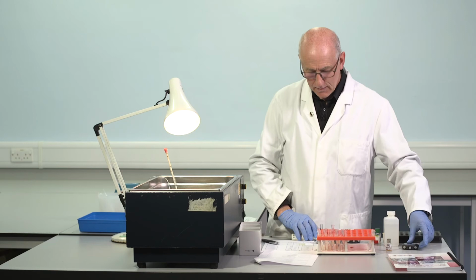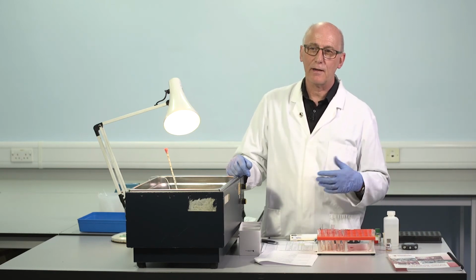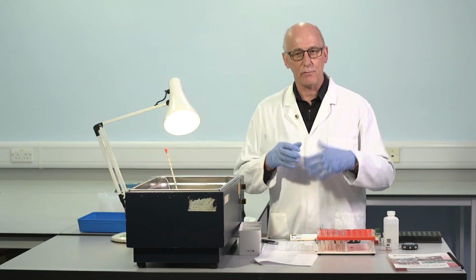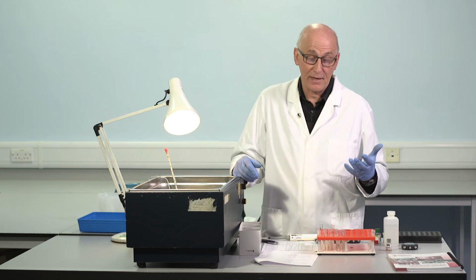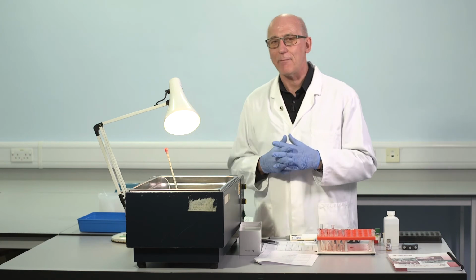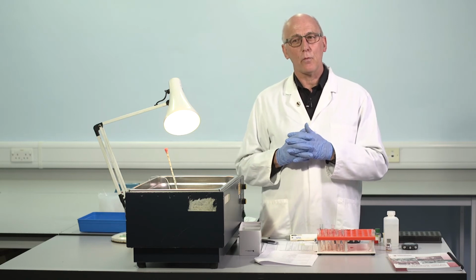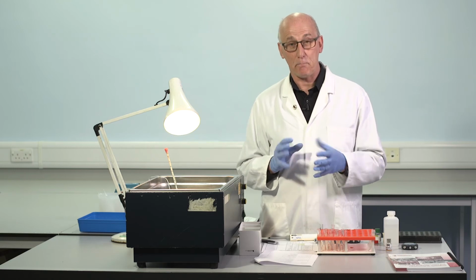Incubated for 3 minutes. So we've got the factor VIII deficient plasma. It contains contact factors, other clotting factors, but completely lacks factor VIII. We know that it clots for the reasons we've already discussed. We'll obtain a clotting time for a sample which completely lacks factor VIII. So just here we want to know what will be that clotting time in the absence of any added factor VIII. And when we get that piece of information, we can use that to assist interpretation of the clotting times from patient mixtures.